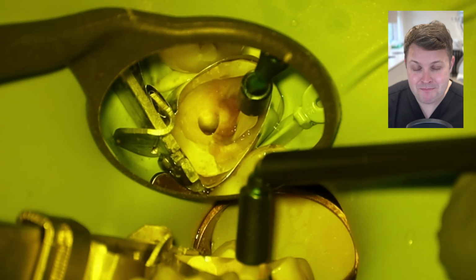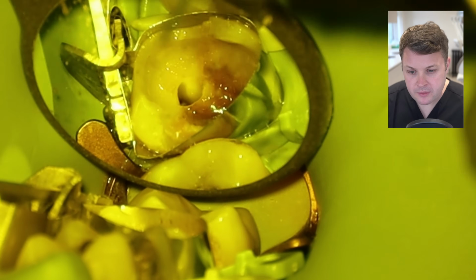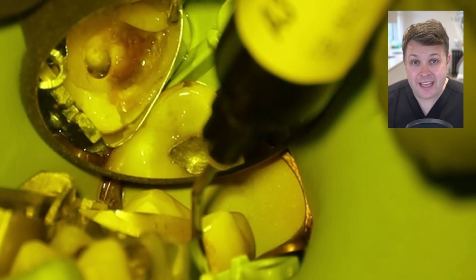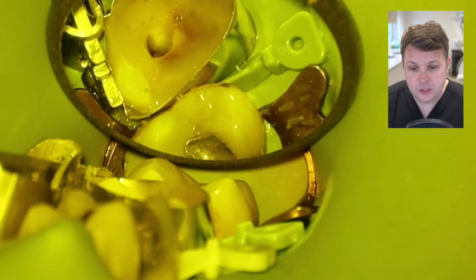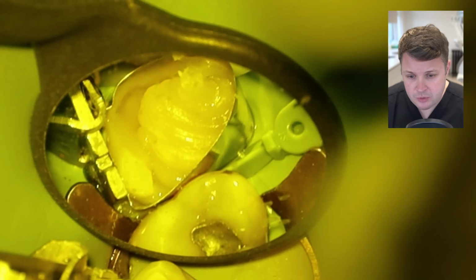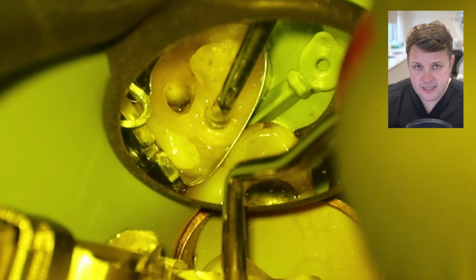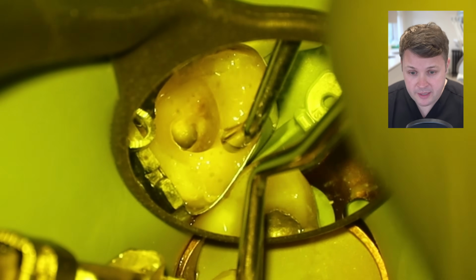I'm going to give it a really good massage into the cavity, and then we're going to use a bit of flow. I always like to use a bit of flow because I feel like it adapts to the cavity floor quite nicely. Just got to be careful you don't use too much of it because we're worried about C factor, of course. And then I'm going to start building up the wall. And maybe in this case, I used a little bit too much composite. Of course, we talk about this C factor issue, but I feel like there's not many surfaces this bonds to, and also I feel like I can cure all the way around this.